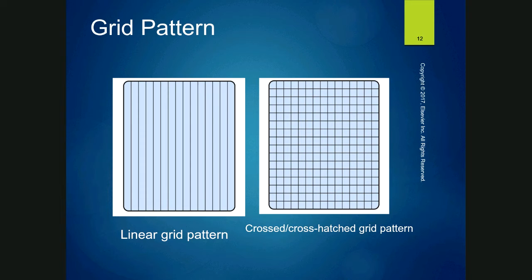Linear grids, when you think about grid construction, you think about when you use grids. A lot of times we're using stationary grids, that's what these are. We're using them on people, we're doing portable x-rays. If they can come to the department and be x-rayed at a wall bucky or in the table bucky, you have more room for error.